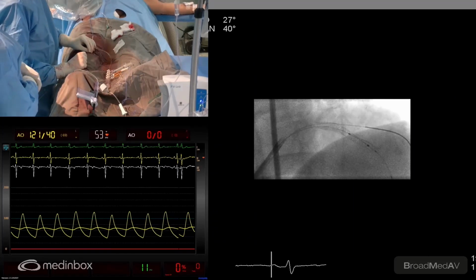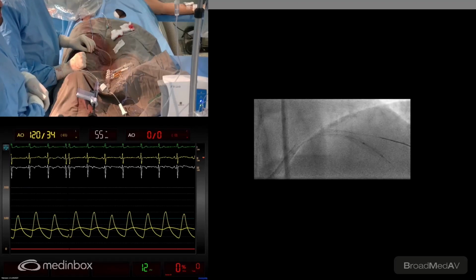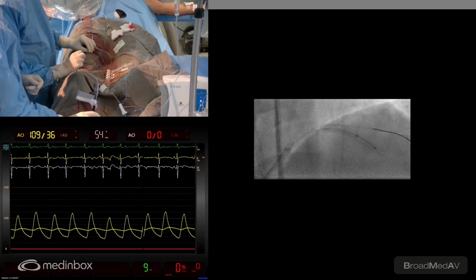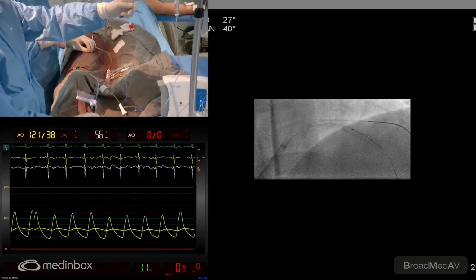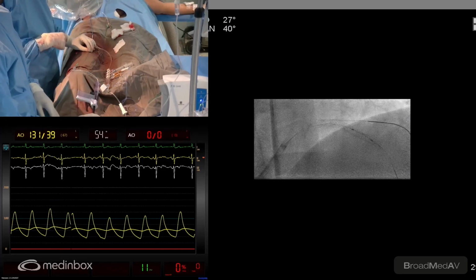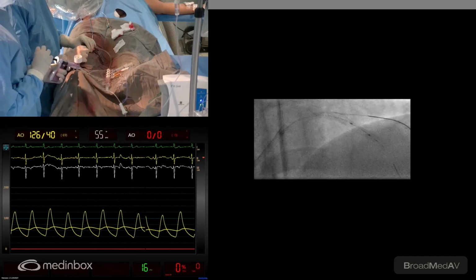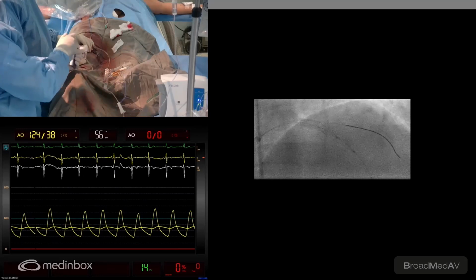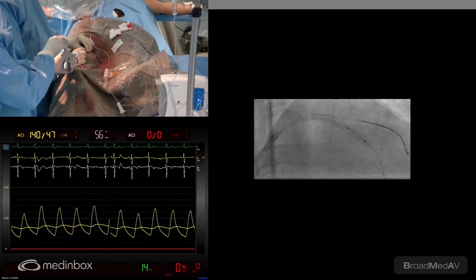All right, so we can fluoro and then take a decision. All right, we need to go a little more. Little bit in. Can we go off the freeze film? Fluoro. All right. We're going to go distally, go in a bit. Yeah, it's okay. I'm pulling it back. Yeah, go ahead.